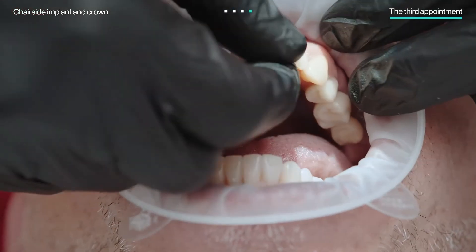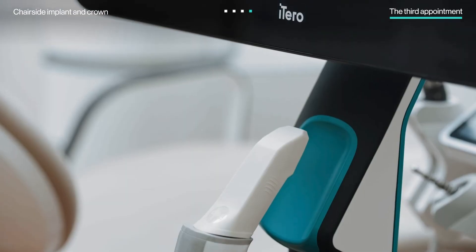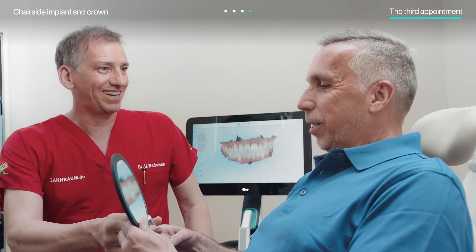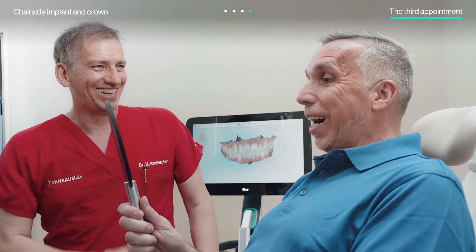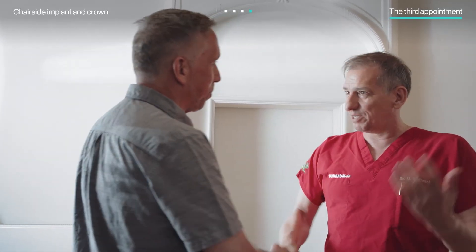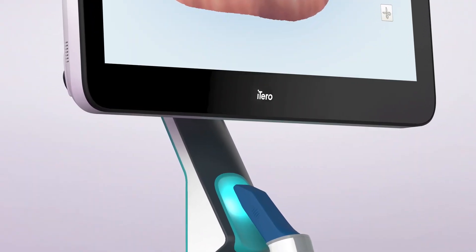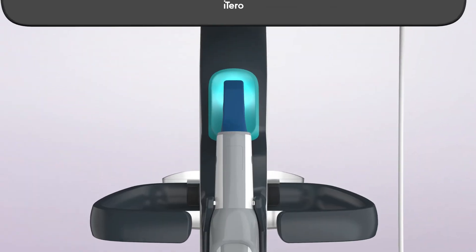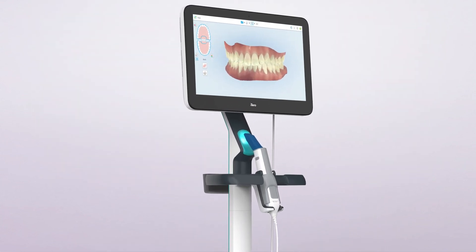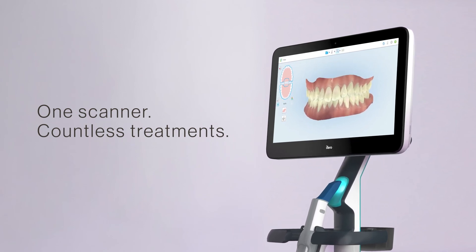It's this kind of efficiency and comfort that helps him achieve more patient satisfaction during treatment. Thanks to the seamless integration of the iTero scanner and ExoCAD software, the treatment was a success, and Dr. Radmacher was able to resume monitoring his patient at routine visits. That's just one example of how the iTero scanner is a versatile tool designed to help you simplify complex treatments, be more efficient with chairside solutions, and much more. Which treatment will you tackle today?